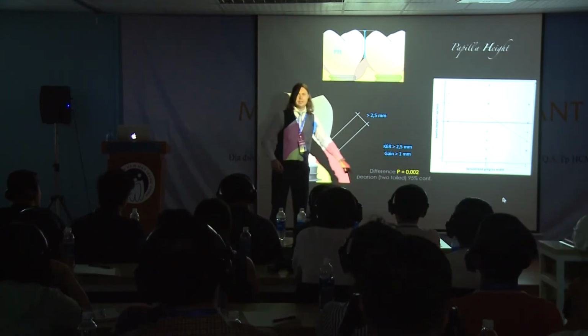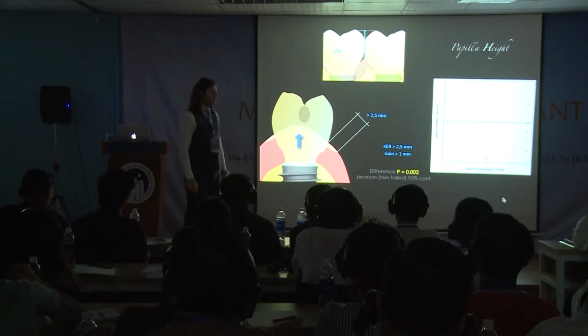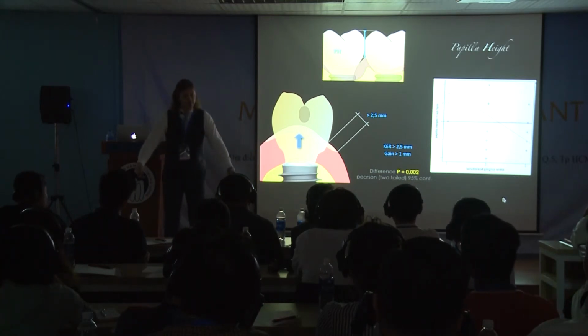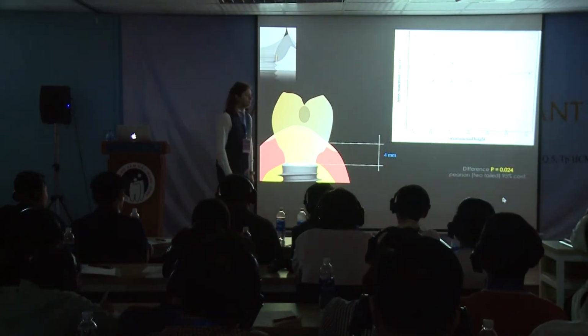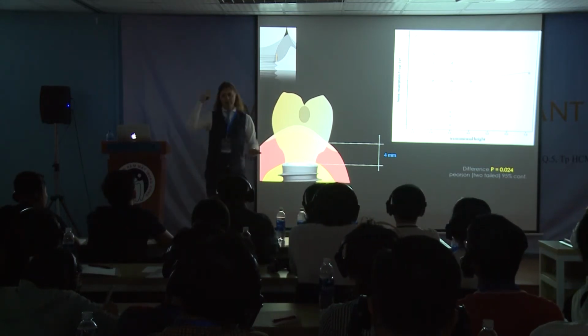This is a really confident number. So you have to surgically act in order to have always keratinized mucosa around the implant. Last number, otherwise you have headache.